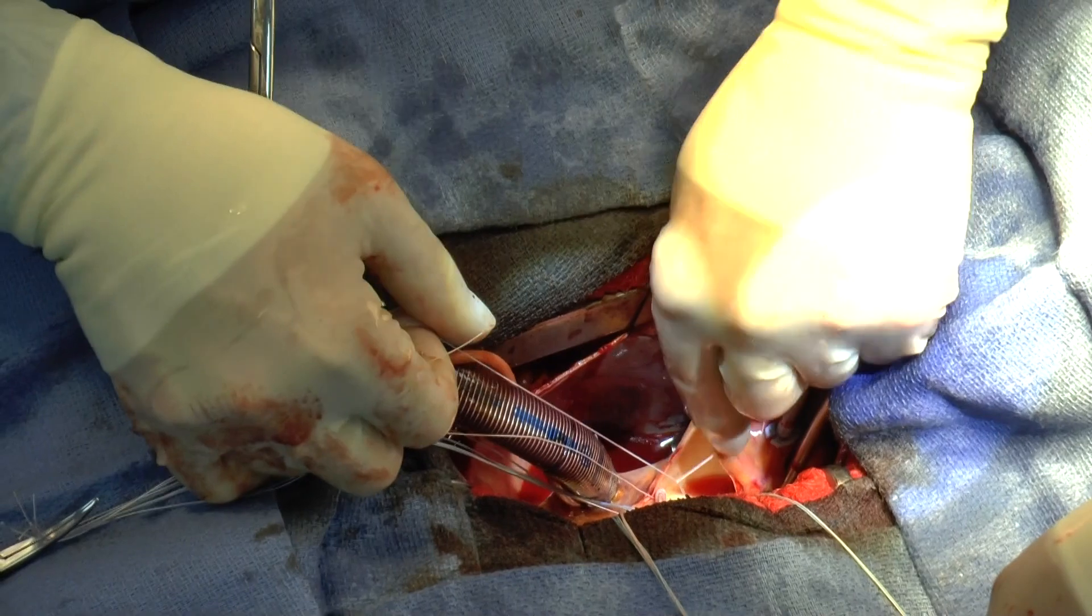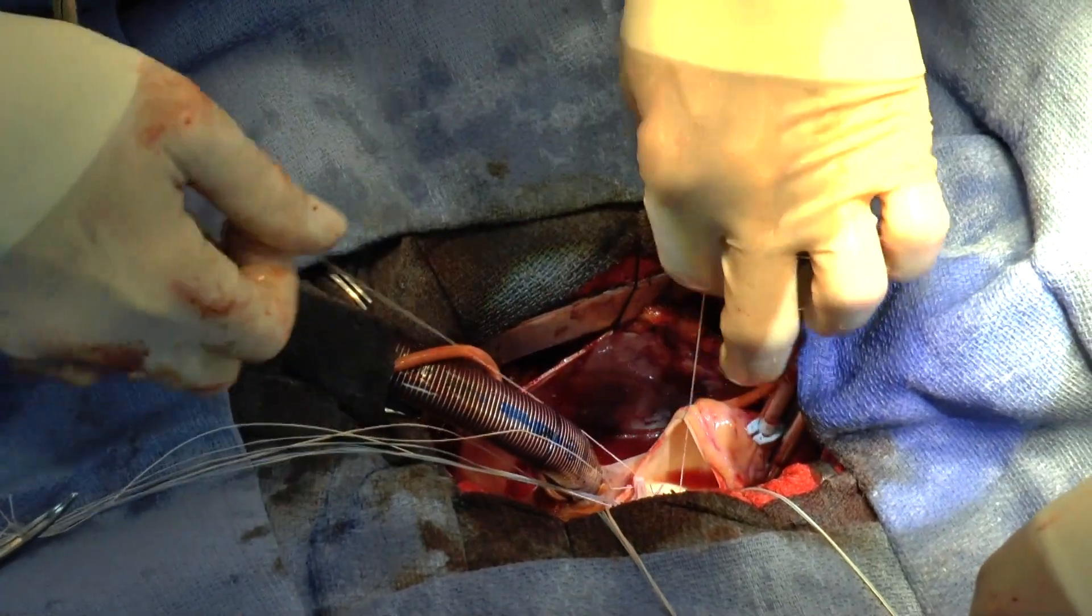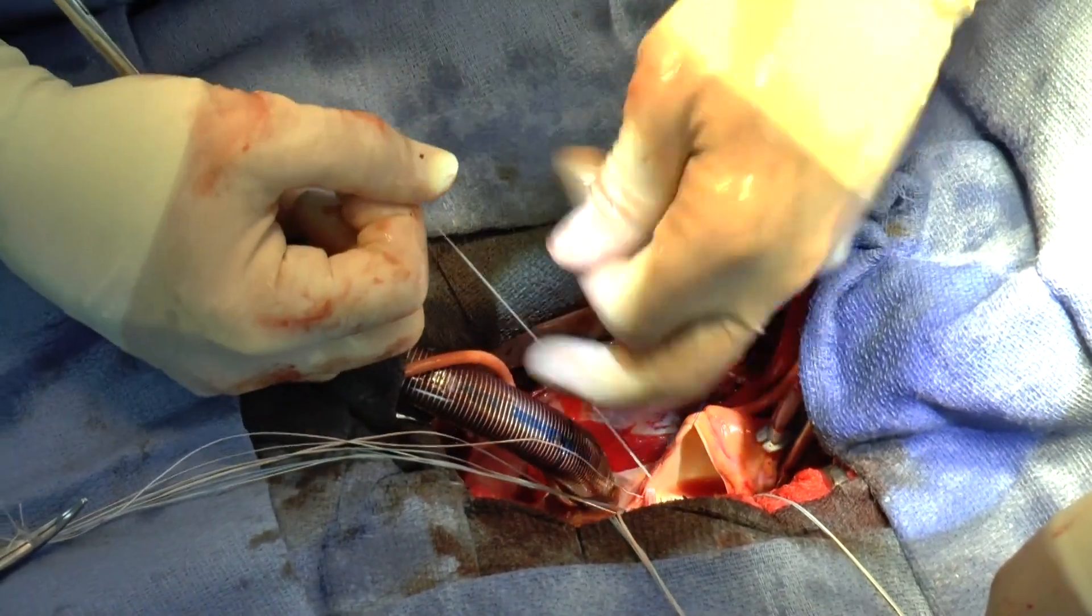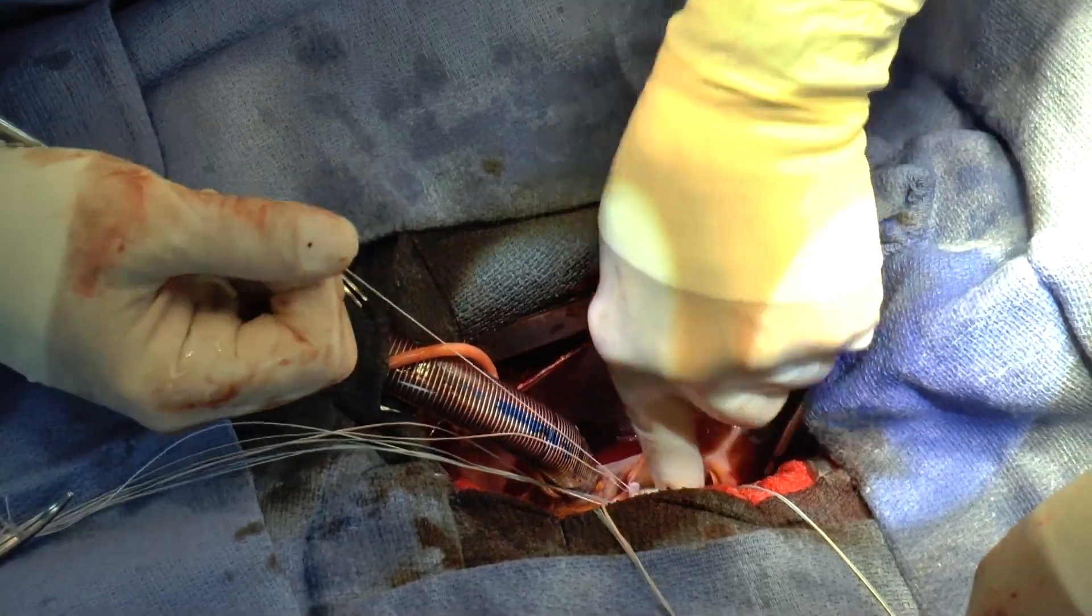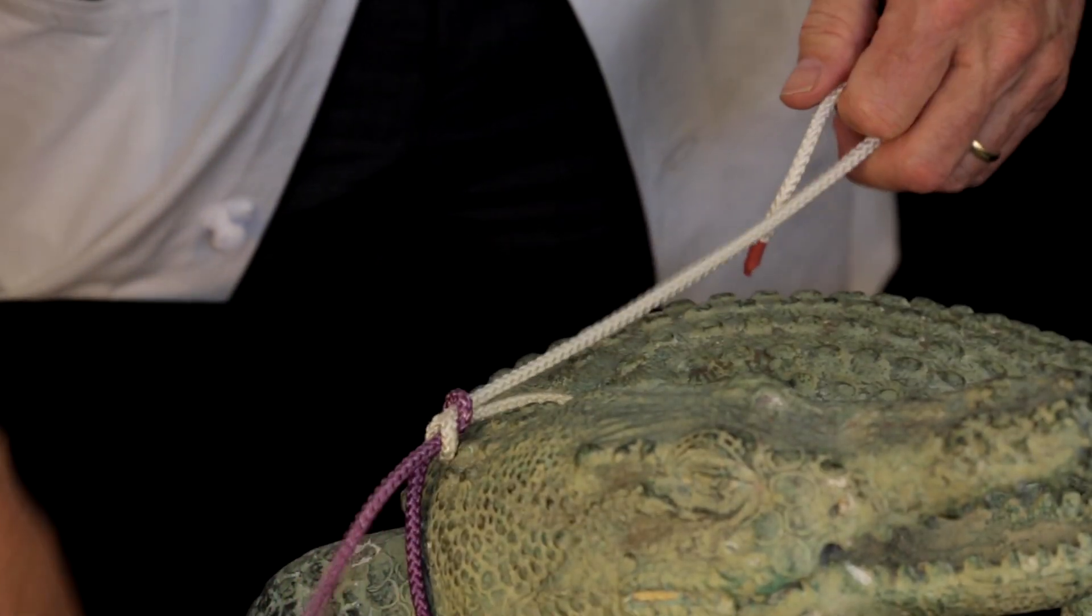On the contrary, in heart surgery, it's all about steadily tightening that loop against the resistance of the tissue. You want to choke the alligator just the right amount.